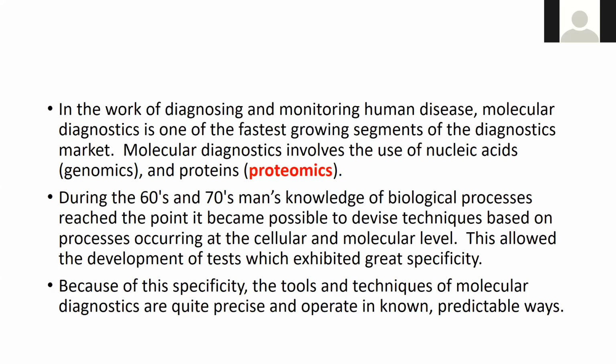Is that fun? And what's the real fun is that it actually streaks for you. You put the drop of the organism on the plate and it has this metallic ball that runs back and forth on the plate and streaks the plate for you. You don't even have to get a loop out to streak. That makes what we're doing feel ancient. Ancient? No, because when you get there, you can do your micro clinical over there. That's why I'm making a mention of this.